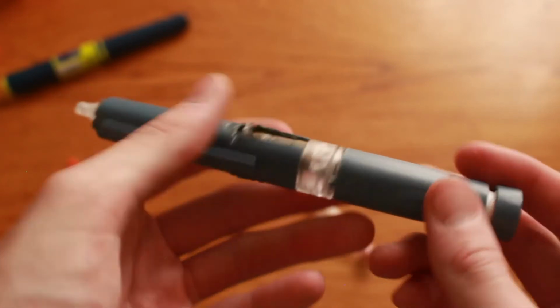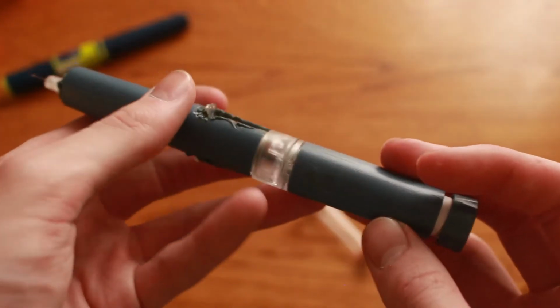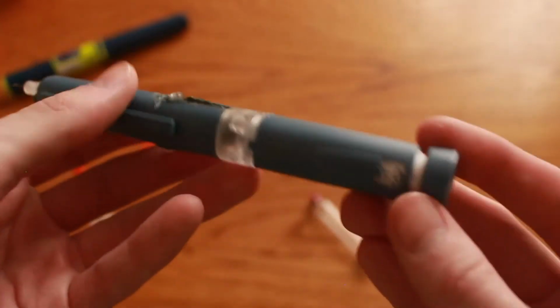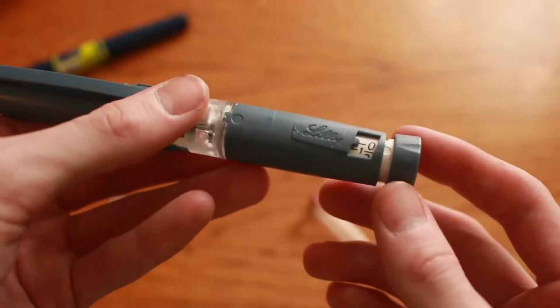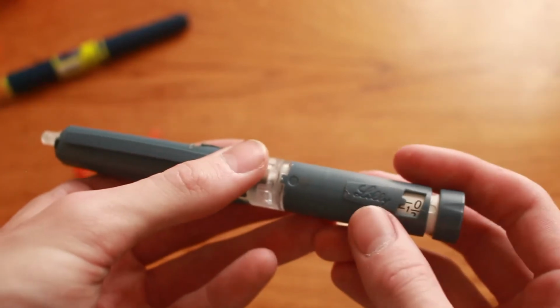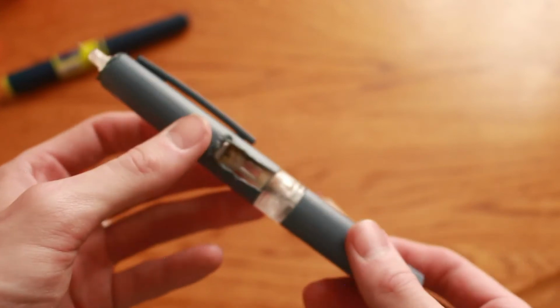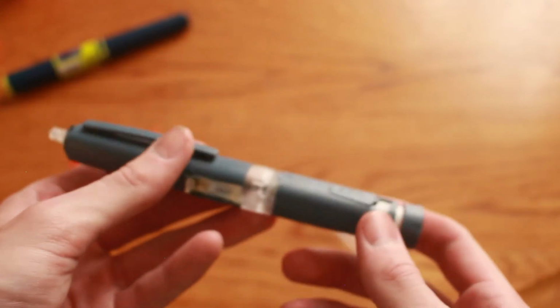Now, it's a bit of a leap of faith because you can't see the inside of it. But I've done multiple tests with this. You've seen the demonstration. For every 10 units, it goes down 1 unit. It really works like that. It is truly incredible.